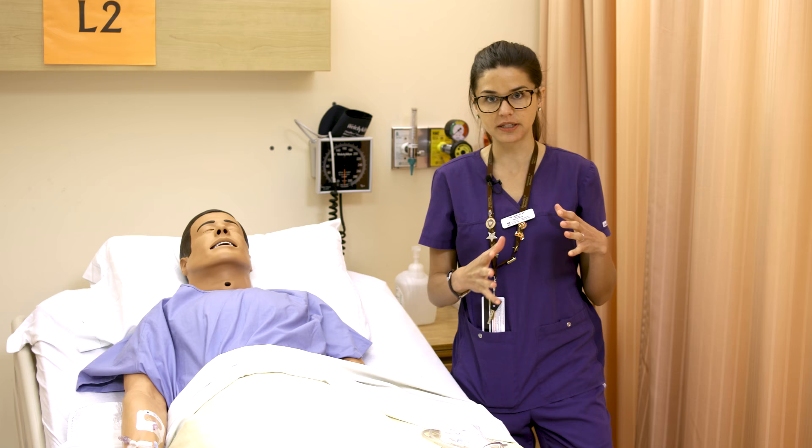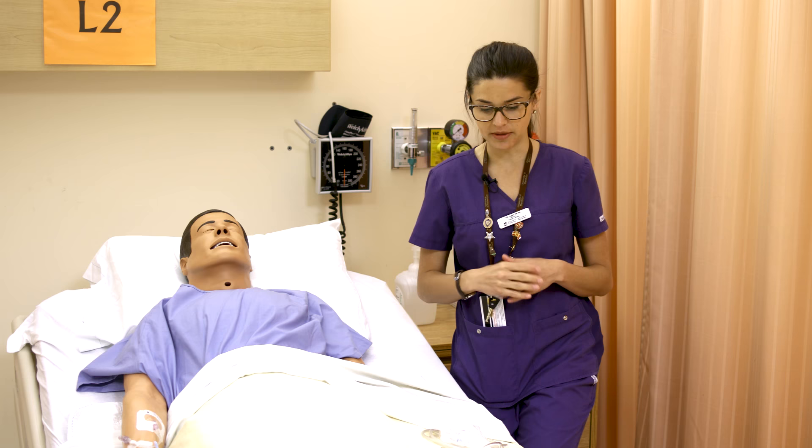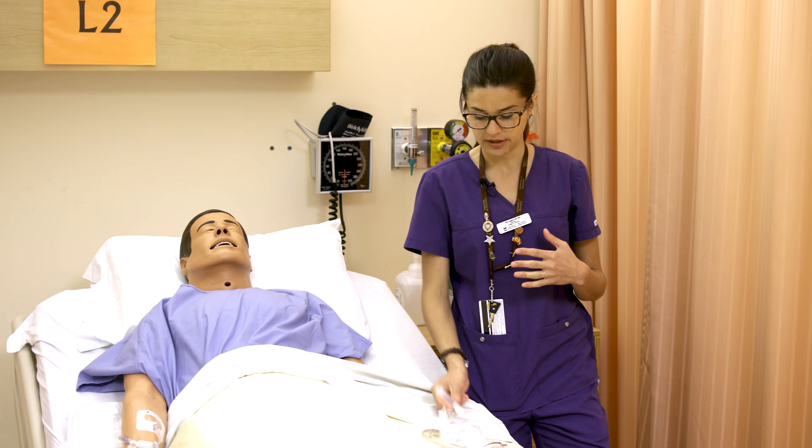We're going to go over nebulizer medications. It's a lot like a puffer, just a little bit different — it aerosolizes inhaled medications and takes about 10 to 15 minutes to run through. The person will either hold a mouthpiece to breathe it in, or we can attach a mask to their face so they breathe it in passively.